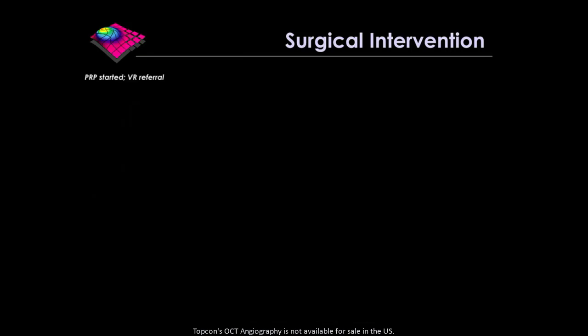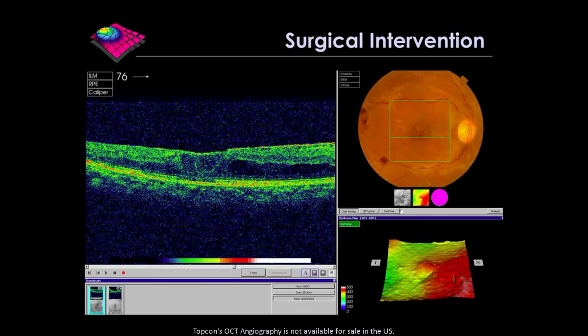So what happens? Well, in the UK we have medical retina specialists like myself and surgical retina specialists, and so I immediately refer her for surgical intervention, and she has a vitrectomy and delamination done in her right eye in September 2017. She gets an anti-VEGF one week before the surgery, which seems to be common practice now. And she comes back and she looks like this.